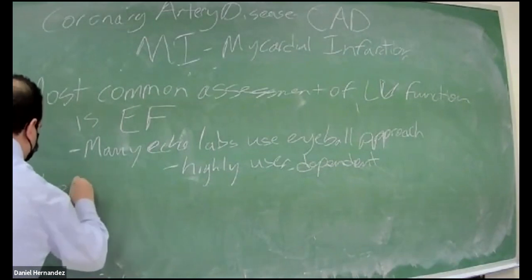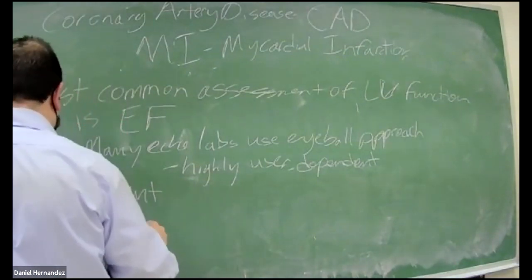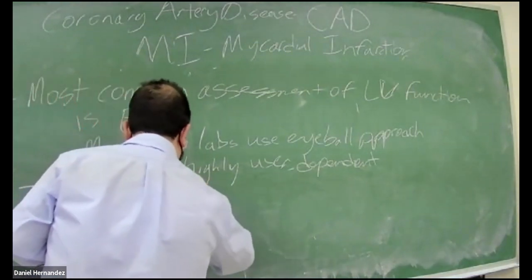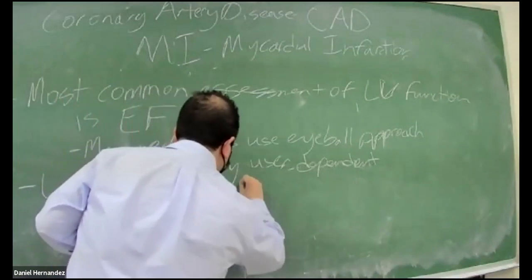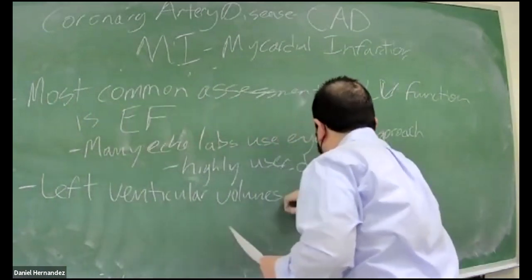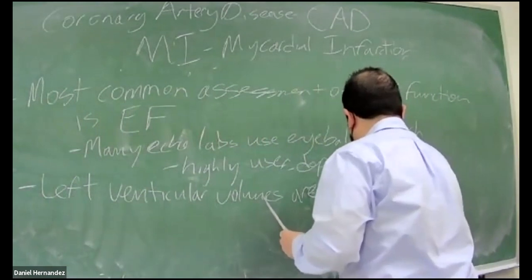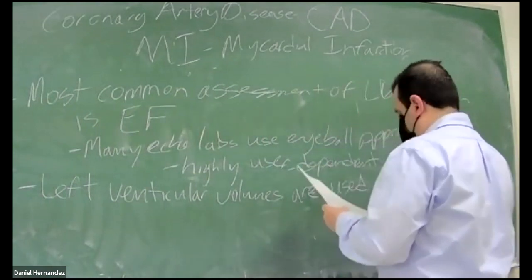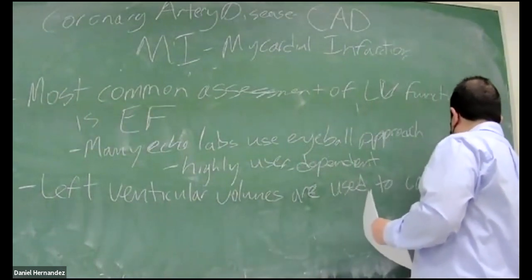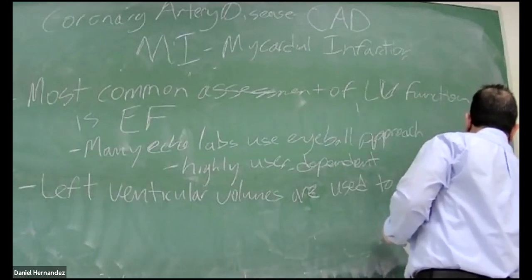So left ventricular volumes are used to calculate EF.